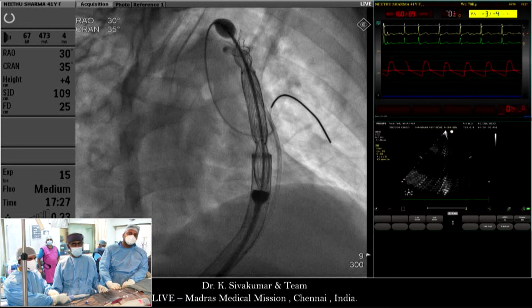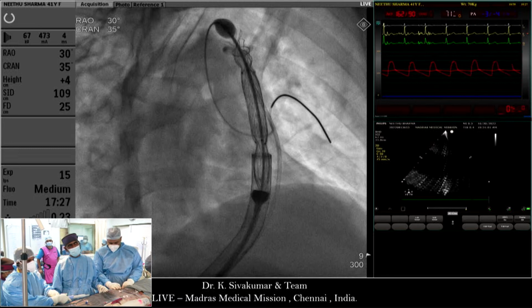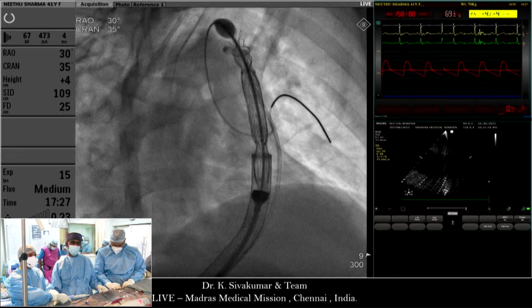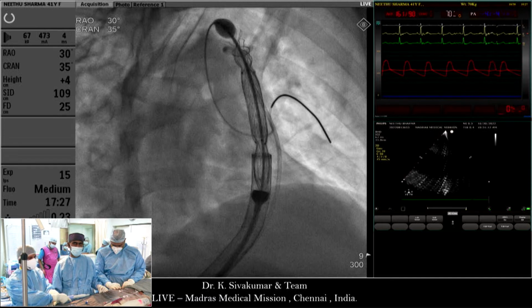It's not always rigidly circular. We have come across this on a few occasions, Varakan, where there is a disparity between orthogonal views by 3 to 4 millimeters. I was not very surprised.